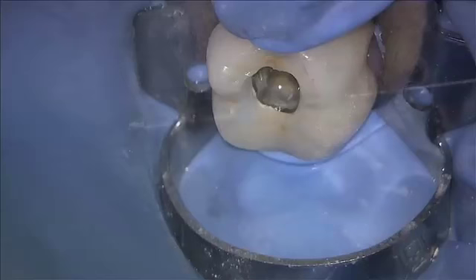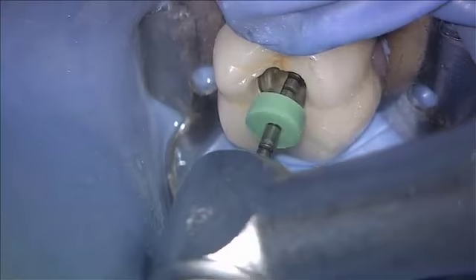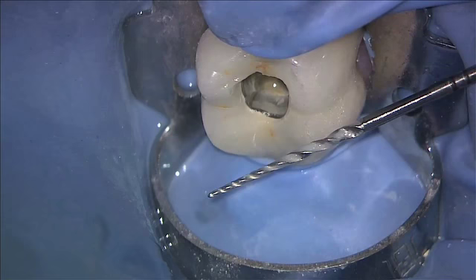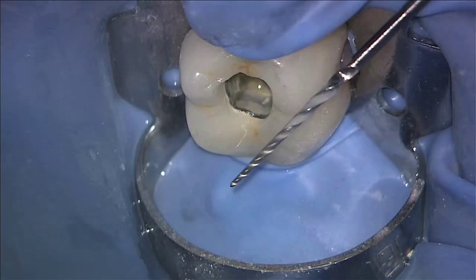This will make it easier for me to get my single GTX file to finish the shape. I know the tip diameter is at 30, so I'm going to bring a 30.06 GTX file in at 300 RPM with a torque limit of about 350. Because the canal has been prepared by the negotiating instruments and the number 30K file, that little guy cuts it right to length. That ideal outcome was accomplished with two rotary negotiating instruments — Vortex 1506 and 1504 — and a single 30.06 GTX file.